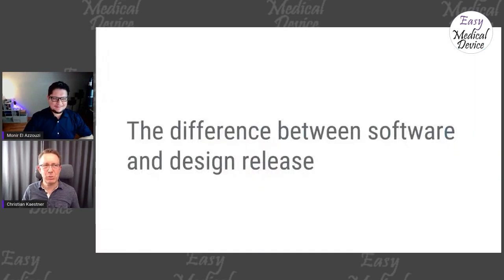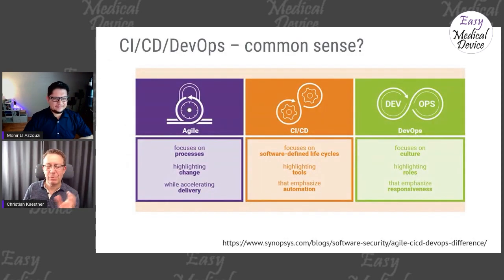Let's have a discussion about software and design release, because I think that's really essential to understand the difference. I've stolen this picture, and I need to give some credit to Synopsys. I Googled, and I found this picture is good enough. It shows the 3 different things which are often discussed.